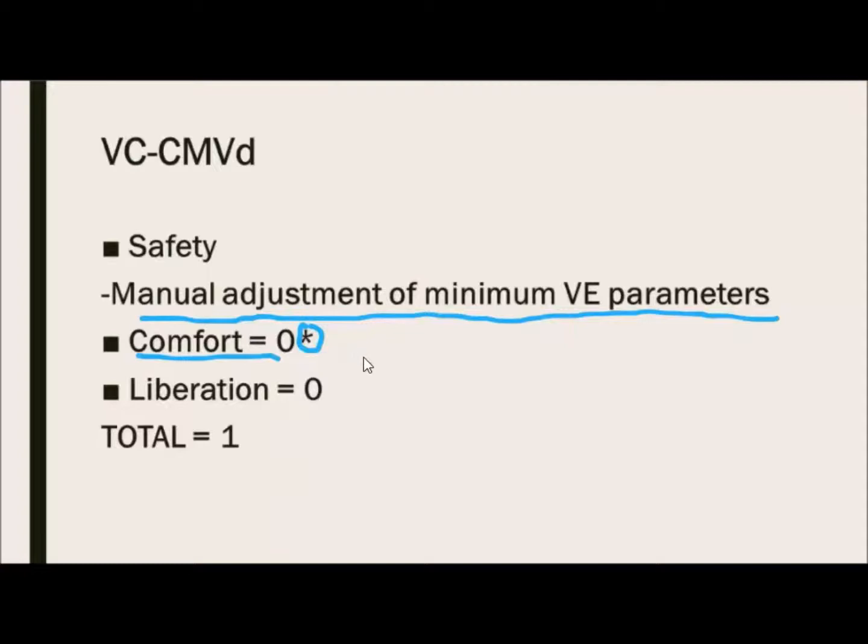It's a pseudo pressure controlled breath. Of course, it changes to a pressure controlled breath for the pressure limitation. However, during a high inspiratory drive, it does not. The flow is still fixed. It never meets that pressure limitation, and the flow does not change. So you still have discomfort and flow asynchronies.